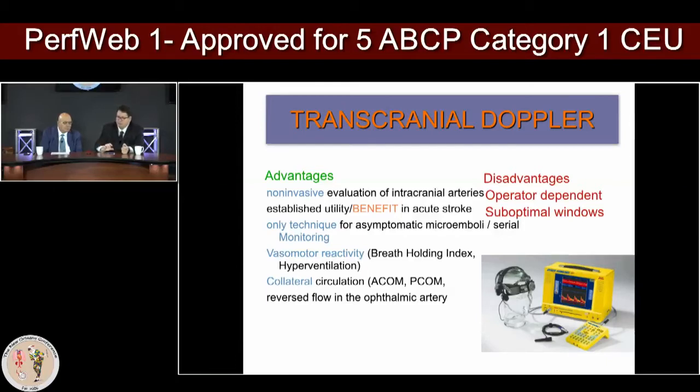And even from that 10%, I would say the number of hospitals that use TCD for intraoperative monitoring is even less. Definitely you and me, if I want to have any kind of surgery, my first question would be who is the anesthesiologist, not just who is the surgeon. I think it's very important, as a team approach, that someone is also looking after your end organ. You can fix my heart, but if my brain is blown and I have a stroke, I really don't care too much how successful the surgery was.